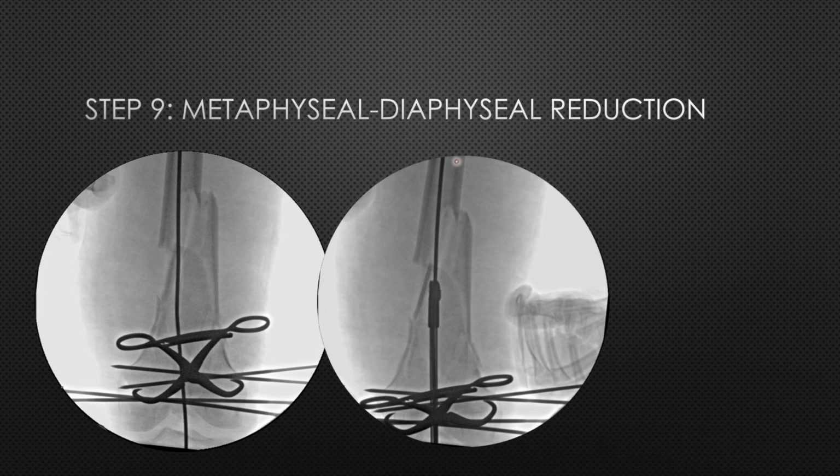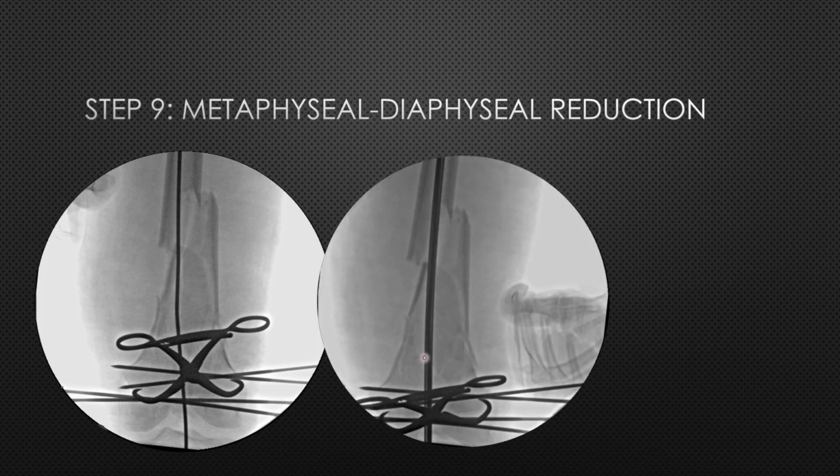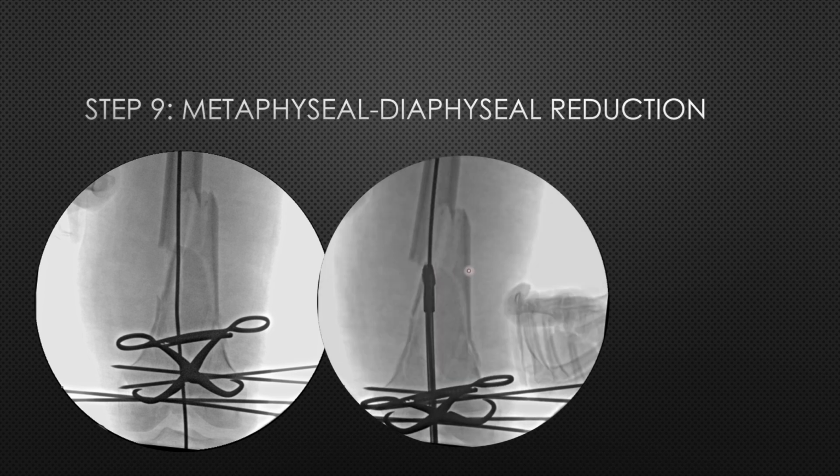So the reaming has been done, and you see these small fragments, they are actually completely free. During the process of reaming, they are displacing, but again we need not worry about that because they are actually the comminuted fragments which need not be anatomically reduced. You have to secure the alignment of the diaphysis with the metaphysis.